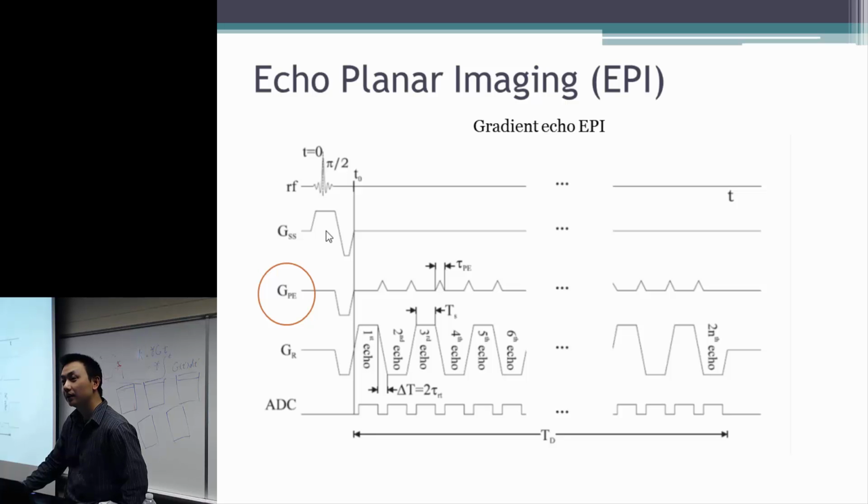At the center of the slice select, the spins tend to dephase. So in order to rephase, again we apply the negative GSS. The area would be half of the total GSS. Right, that's correct. So yes, this is actually the slice select rephase gradient.